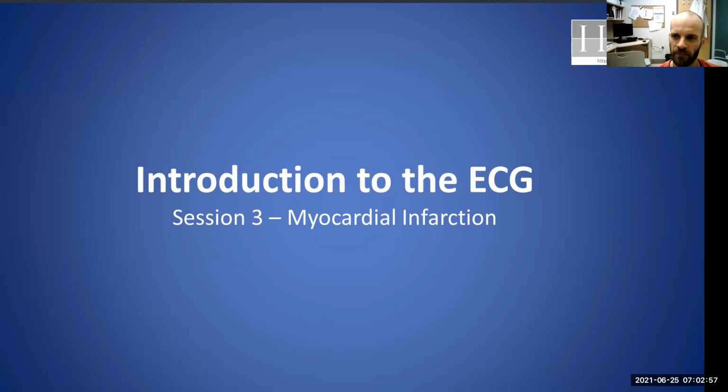Okay, fine. So at Lauren's request, we'll do a session today on myocardial infarction. This in itself isn't quite so relevant to the inherited conditions, but the ECG patterns are really common ones. Some of the ECG patterns may mimic things that we see in the inherited conditions sphere, and I think it's generally useful stuff to be able to hone your skills in understanding what's going on with these ECGs. Important stuff to know about.